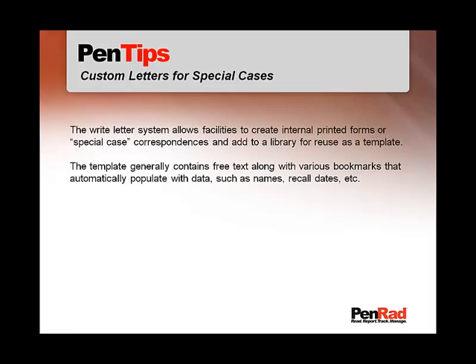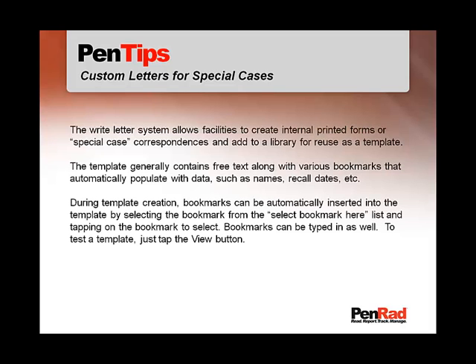The template generally contains free text along with various bookmarks that automatically populate with data, such as names, recall dates, etc. During template creation, bookmarks can be automatically inserted into the template by selecting the bookmark from the Select Bookmark Here list and tapping on the bookmark to select. Bookmarks can be typed in as well.